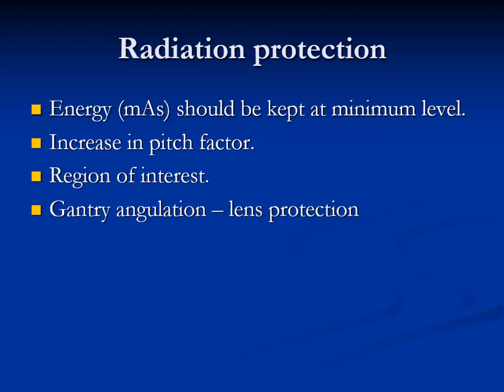Radiation protection. Energy, mAs, should be kept at minimum level. Increase in pitch factor. Region of interest. Gantry angulation, lens protection.